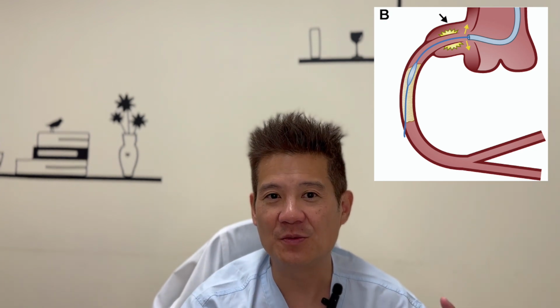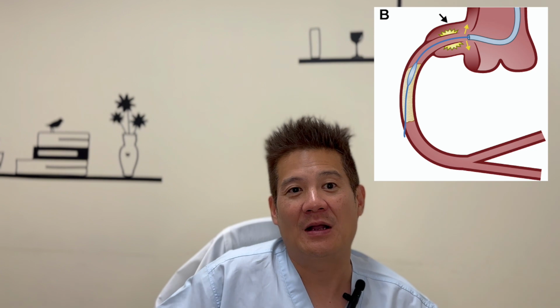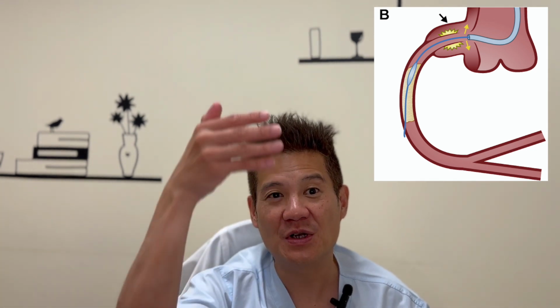If you don't deal with this immediately, there's a risk of dissection up the aorta, and there's a risk of expansion down into the distal to cause tamponade. So we must deal with this quickly. Now, this is not in the paper, but from my own experience, I found that often the cases that have trouble covering the entrance site with a stent are the cases that I've left for some time. Either I was unaware that I've caused a dissection or a hematoma, or I haven't got the right stent.